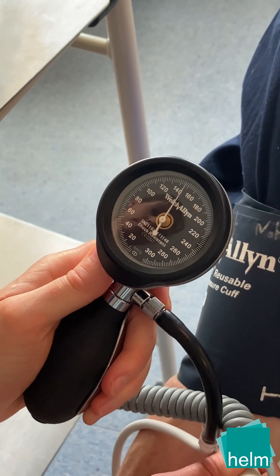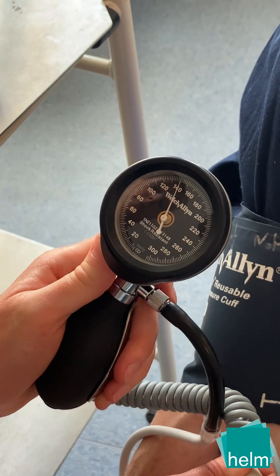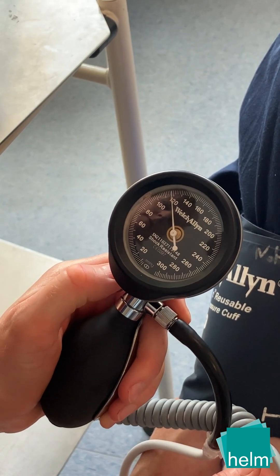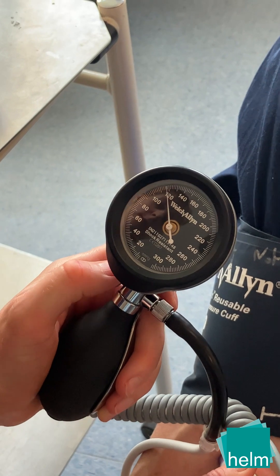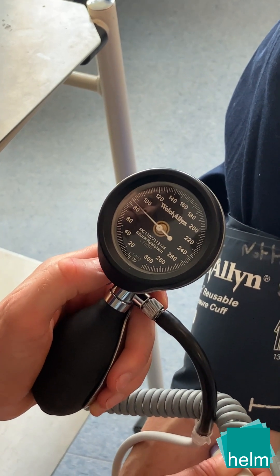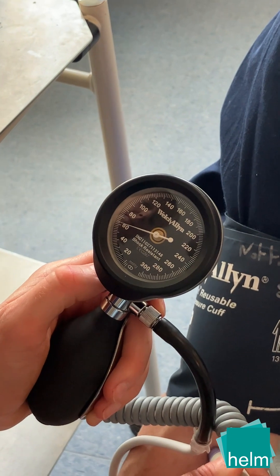The pulse resumes at around 115 mmHg — this is the systolic reading and is the first Korotkoff sound. Essentially, two tapping sounds indicate that the artery has started to open.